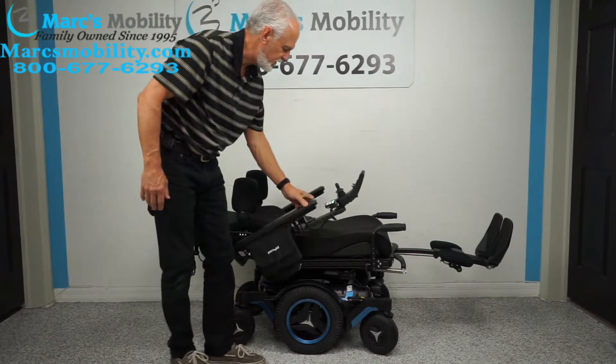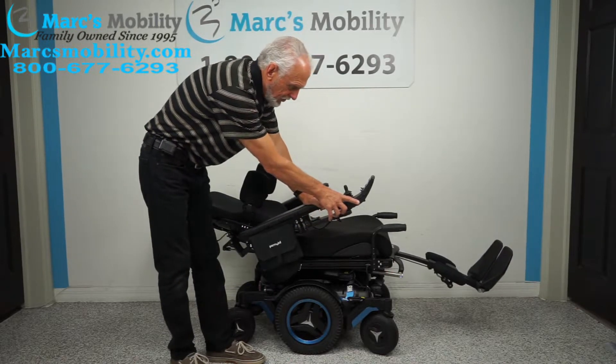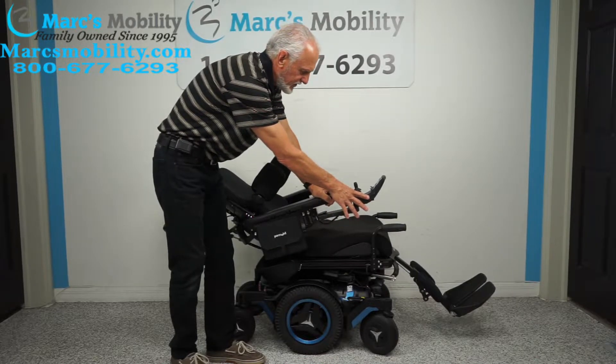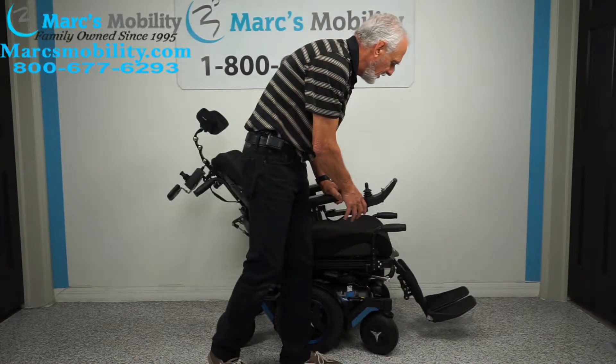You can see how the arms flip up — this is your laying-down position. I'm going to bring the back up and the legs down at the same time. Notice the legs are going down while the back is coming up. If you want to do two functions at once, you can hold two buttons like I'm doing, or do it through the joystick with one button.